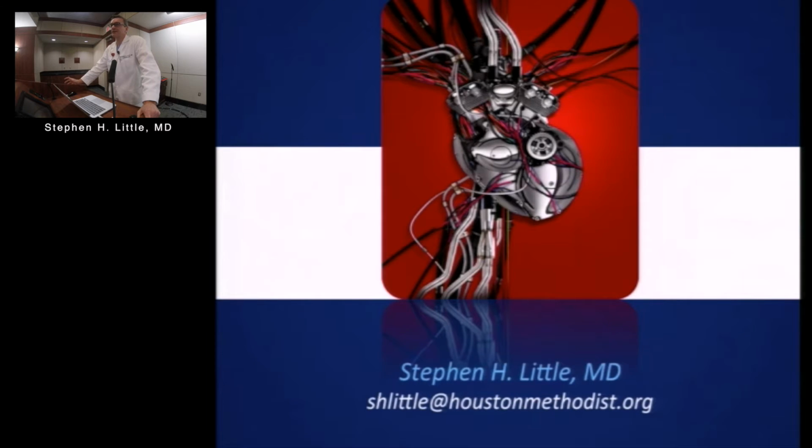I mean, you don't really need a 3-centimeter mitral orifice. You can get away with it too, because nobody has significant stenosis until you're down to 1.5. So the gradients across the mitral valve after this procedure are good. The challenge with that procedure is that people are so sick, and it largely requires a transapical approach. And transapical, whether it causes morbidity or it's just a marker of sick patients, the 30-day death rate for transapical mitral valve-in-valve is still high. But the gradients aren't.